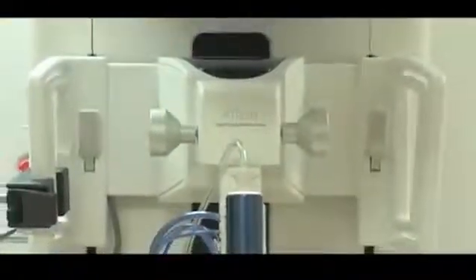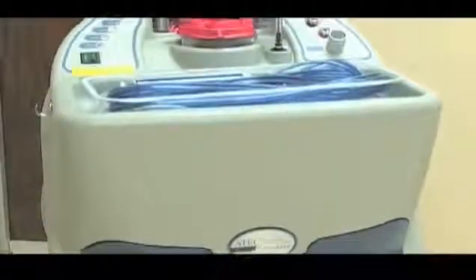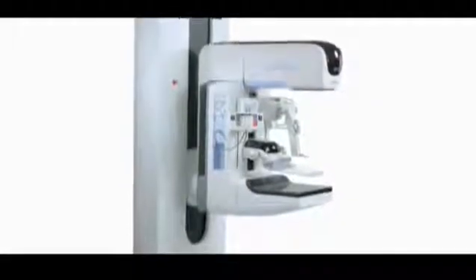This presentation will feature the Affirm Upright Breast Biopsy Guidance System for use with the Selenia Dimensions Mammography System and the Atec Sapphire Console with the Aviva Breast Biopsy Device. Designed to work seamlessly with any Selenia Dimensions System, the Affirm Guidance System delivers exceptional images, accurate targeting, and streamlined workflow.